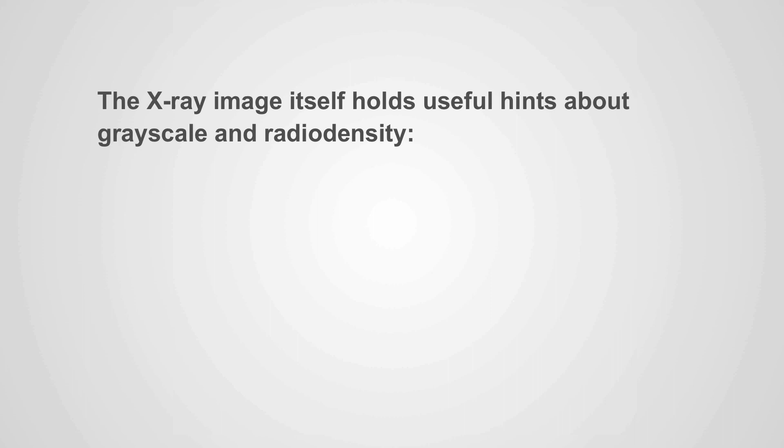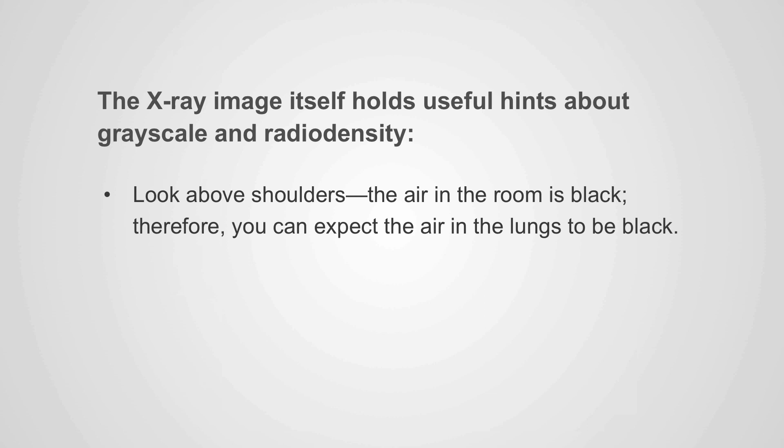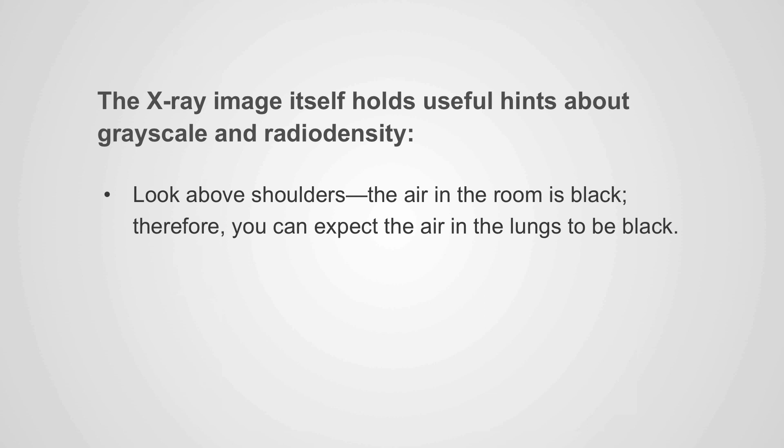So in recap, the x-ray image itself holds useful hints about grayscale and radiodensity. Look above the shoulders. The air in the room is black. Therefore, you can expect the air in the lungs to be black. Easily recognized bones such as the clavicles are white. The heart is soft tissue density and is gray. The x-ray markers are made of lead and are very white.